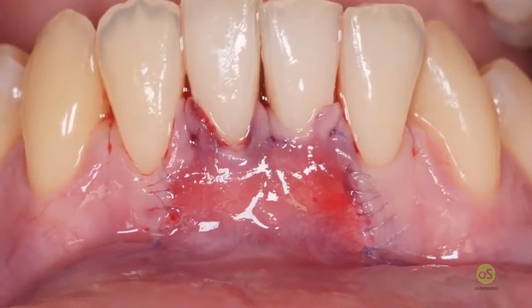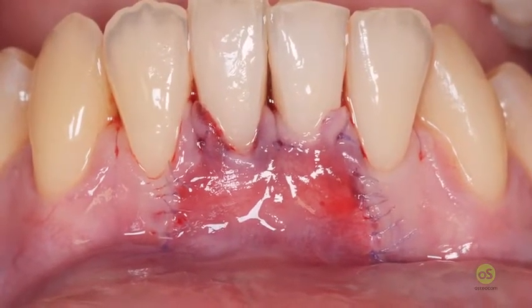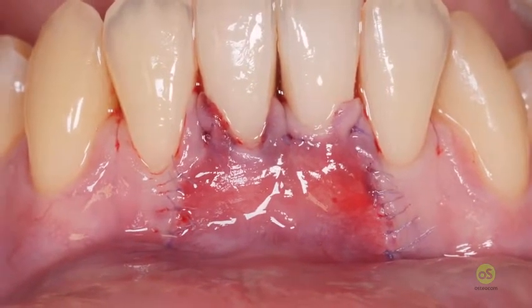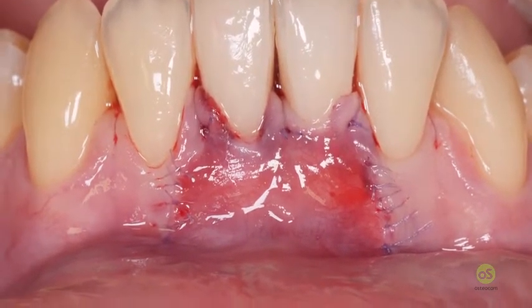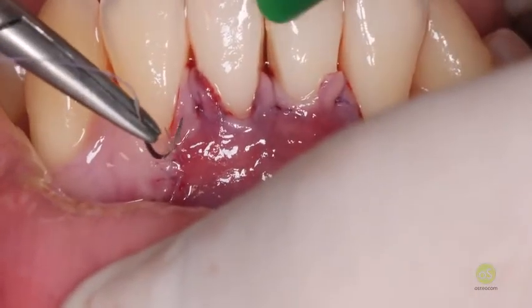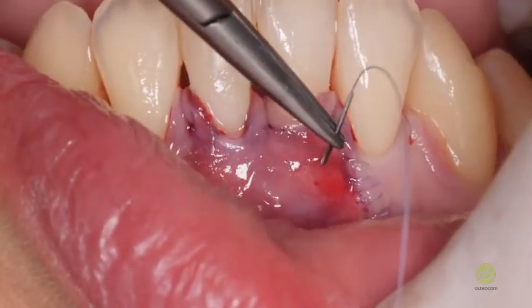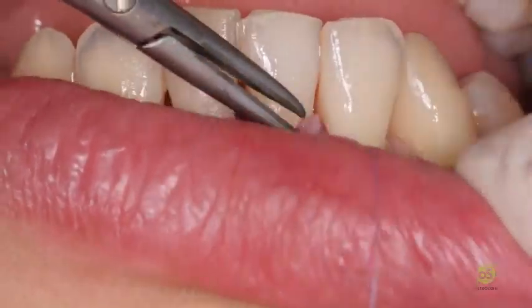But now we have to close definitively the papilla, and the previous sutures have to be removed because they were done where there was still tension. But you don't have to remove the suture first. You have to give the suture again so that you can remove the others once the papilla is in the position. So I will start with this suture. More apical than the others, in the middle, surgical, anatomical, lingual aspect, right?